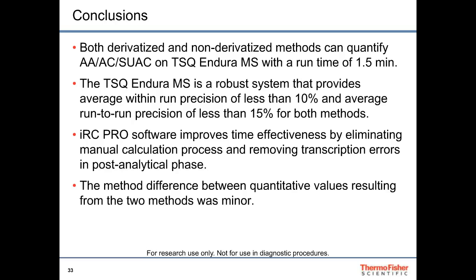Okay, thank you. And another question, how many samples can IRC Pro process at a time? So there's no limitation in terms of the number of samples processed by IRC Pro software. Usually it takes 3 to 5 seconds to process one sample, depending on the complexity of the calculation. But if you want to process hundreds of samples at a time, you better run the software on a very fast computer with high capacity of the CPU and the RAM.